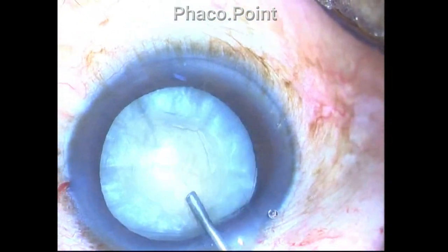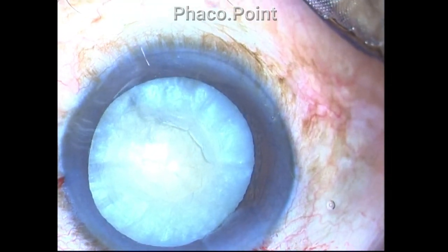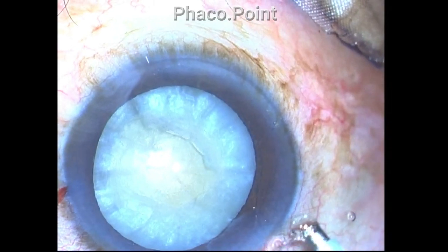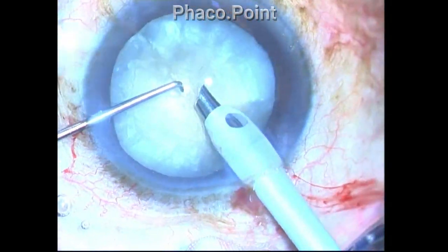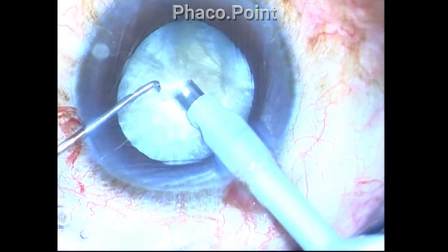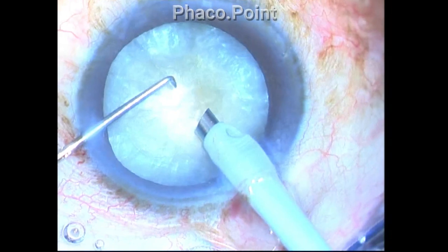So, let's see how the phacoemulsification procedure went. I'm employing the direct phaco chop technique in this case. Because the phaco tip was a little frayed, I requested a new tip, which I was provided with. You can see that it's a brand new tip. And I go ahead with phacoemulsification. And even at the very start, when I went into foot pedal 2, notice that there was a fluctuation of the anterior chamber and a shallowing of the anterior chamber.